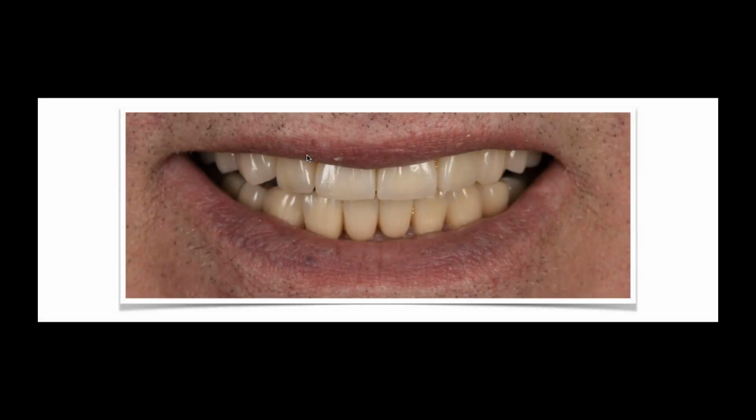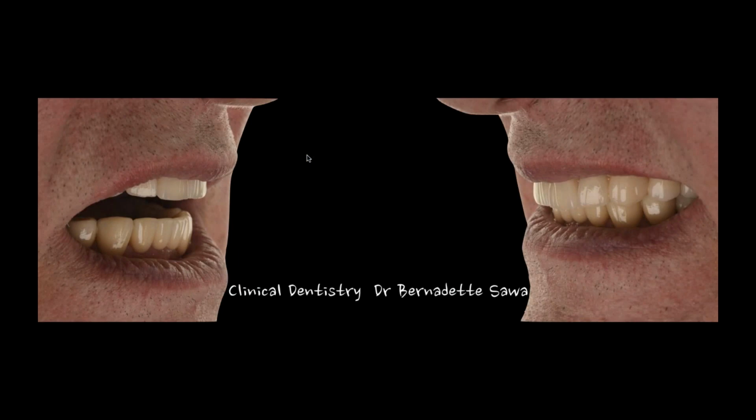And I think whatever the material is, metal ceramics, it's the same challenge. Now, in this particular case, I don't want to say it's easier, but the fact that we had a full mouth of prepped teeth, so we're dealing with 1.5 millimeters, 1.2 millimeters, and that's what my metal ceramic materials were made to work in. So it's kind of ideal. It's kind of what should be the standard of restorative processes when you're in full coverage.